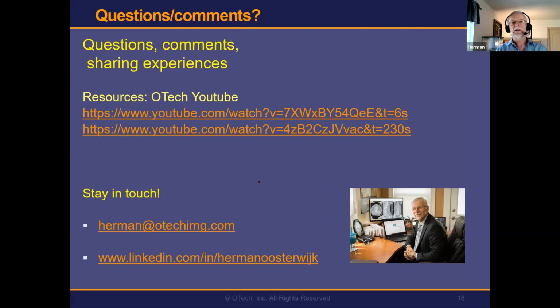So actually, what I would do is say, let's make sure that everybody supports OMI. If your Modality Worklist provider or some of the other systems, or your PACS that wants to see the orders, does not support OMI, no big deal. You go to the interface engine and you tell your HL7 interface programmer, I want you to map from OMI to ORM for those systems that don't want to see the OMI, so they can only talk ORM. So OMI, I would recommend it, but be aware that not everybody supports it. And in that case, you go to the HL7 engine and you do the conversion. Good question. Awesome. Thank you, sir.